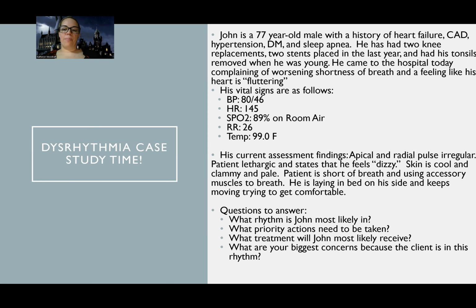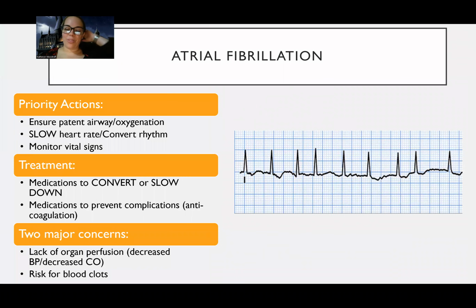So, what do you call it? More than likely, what is John in? Most likely he's in atrial fibrillation. Let's go ahead and move on to the next one. So most likely he's in atrial fibrillation. What are my priority actions?